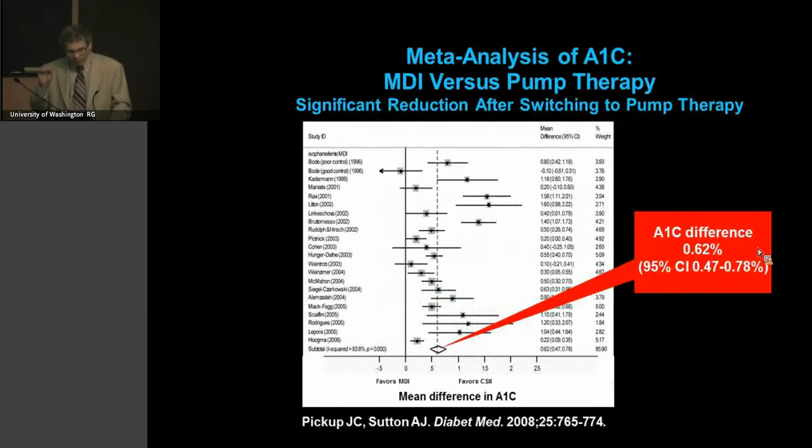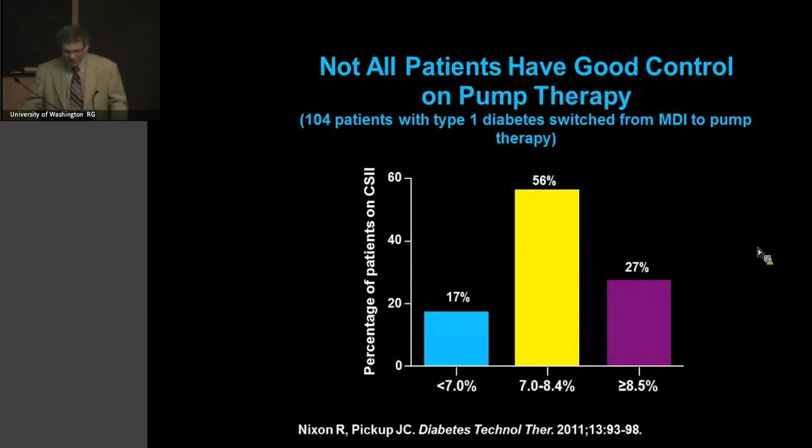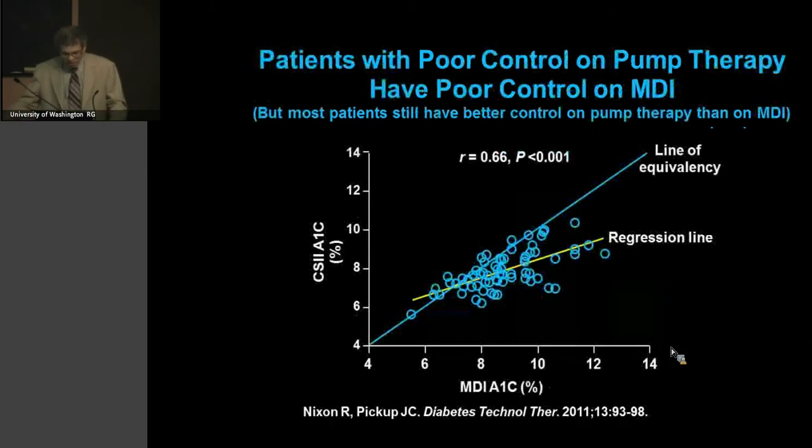But importantly, and I think those of you who see our patients in the Diabetes Care Center know that not everybody who is on an insulin pump does well. It is not a panacea. Patients who don't do well on injections are not necessarily going to do well on pumps, and in this one survey, over a quarter of patients had very high hemoglobin A1Cs, and this just is another analysis of really the same point, that people on multiple daily injections who had high A1Cs also had high A1Cs on pumps. The pump by itself is another way of insulin delivery, but somebody with a very high A1C, what that really means is that they're not doing enough checking, they're not matching their food with their insulin well enough, they're really not doing what they need to do.